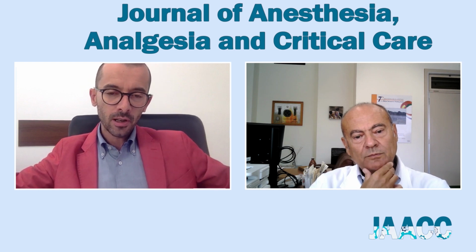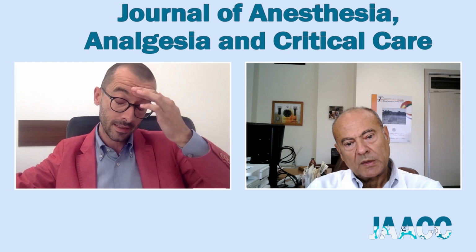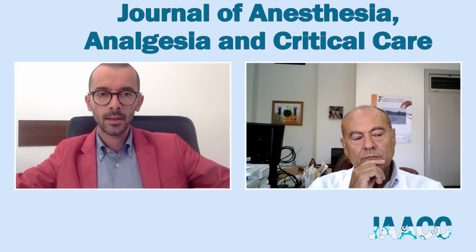Well, this paper focuses on the use of high-flow nasal cannula during fiber optic bronchoscopy, and we have analyzed the possible use of high flow in patients with acute respiratory failure in critical care settings. We have highlighted how it is important to use high flow nasal cannula rather than conventional oxygen therapy in patients with mild to moderate acute respiratory failure. So if we have a patient with a PaO2/FiO2 ratio greater than 150, it will be better to use high flow nasal cannula over conventional oxygen therapy.